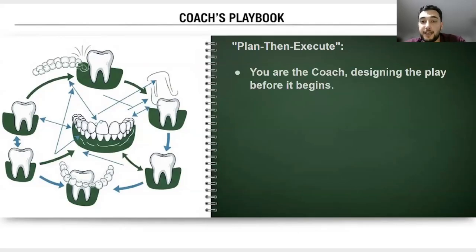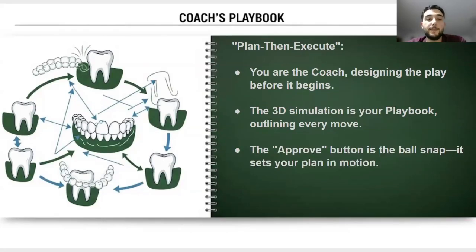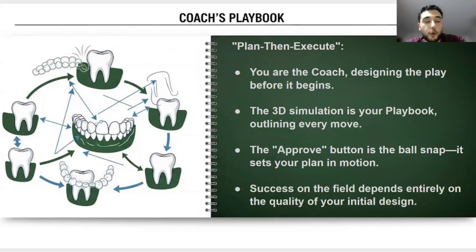And when you're designing the case before it begins, just a second, I need to move this window. Yeah, I was saying, you are the coach designing the play before it begins. And the 3D simulation is basically your playbook, your plan for the game. It outlines every move or force you're going to apply to the teeth. And once you approve the plan and the aligners are manufactured and inserted into the patient's mouth, it's like the ball snap, and it sets your plan in motion. So success on the field or in your treatment setup will depend entirely on the quality of your initial design or your initial 3D simulation of the treatment plan.